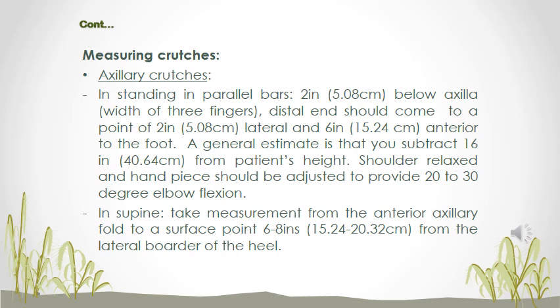What shoulders relaxed means is that if you pull your shoulders up to your ears, that will change the height and the setting of the crutches. So instruct your patient to relax their shoulders while you are adjusting the length. If you decide to measure the axillary crutches in supine, take the measurement from the anterior axillary fold to a surface point 20 centimeters from the lateral border of the heel, and that will guide you with your measurements.